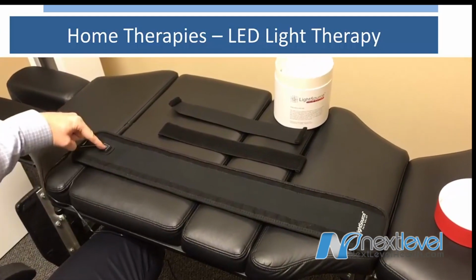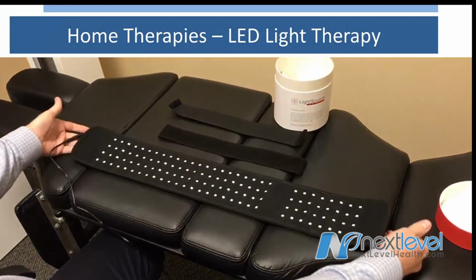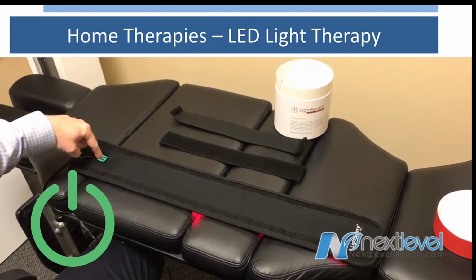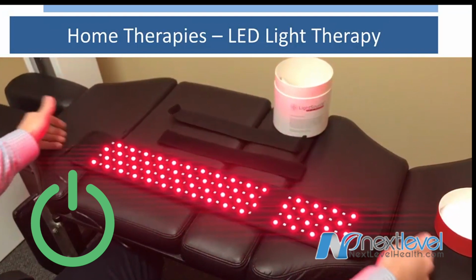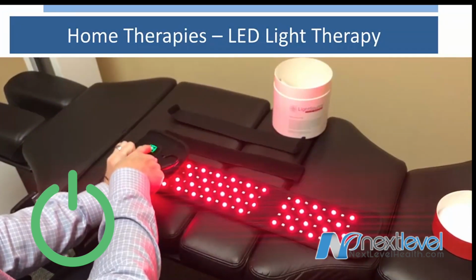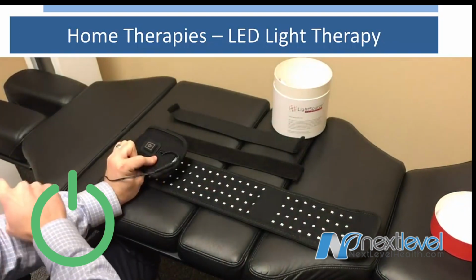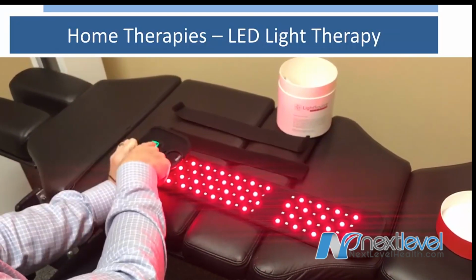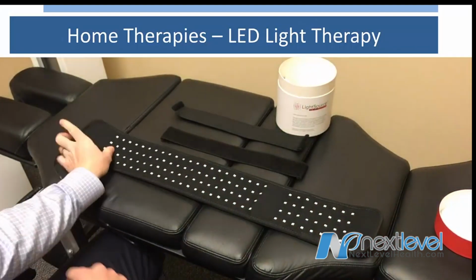The power switch is on the back side of the lights. To turn the unit on, press and hold the power button until the red lights turn on. There is a 20-minute timer. The lights will automatically shut off once the 20 minutes is done. If you need to shut the lights off before, press and hold the power button down until the lights turn off.